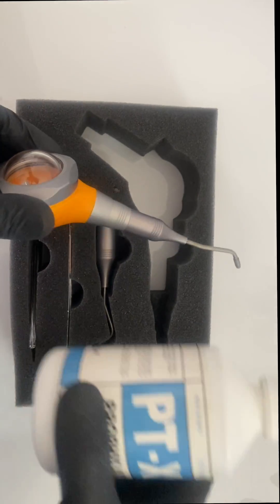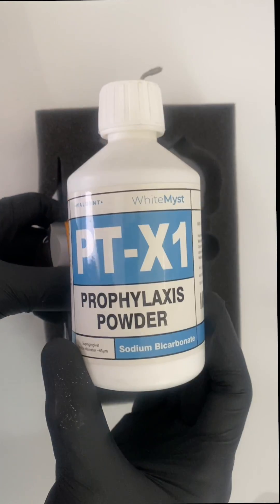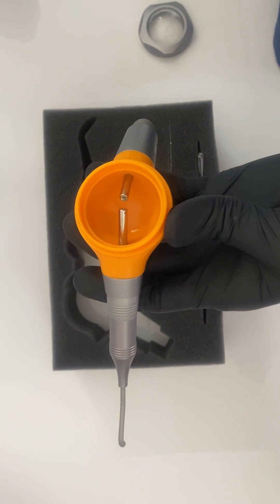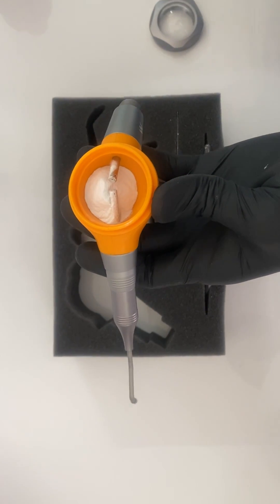So, here we are going to use the Walden's air polisher. Instead of using the sodium bicarbonate prophylaxis powder, we are going to fill the tank with 30 to 50 micron aluminium oxide particles and use it for substrate cleaning.